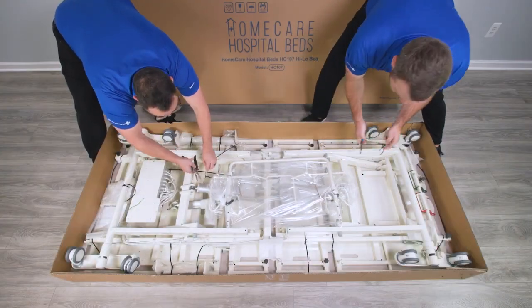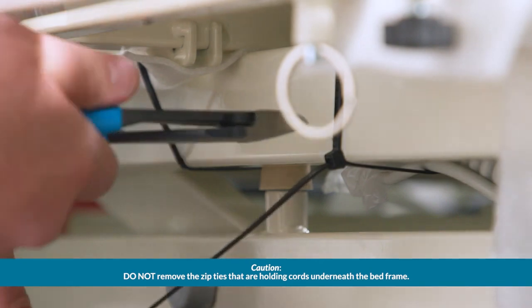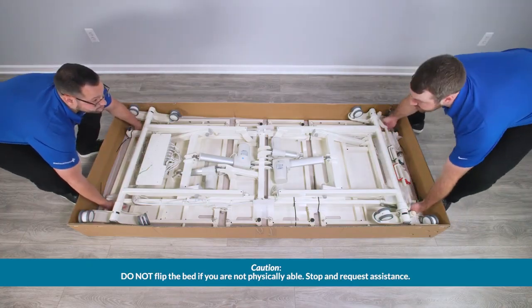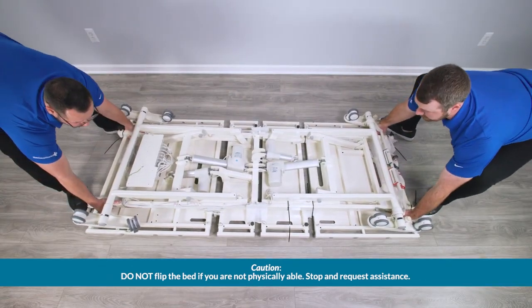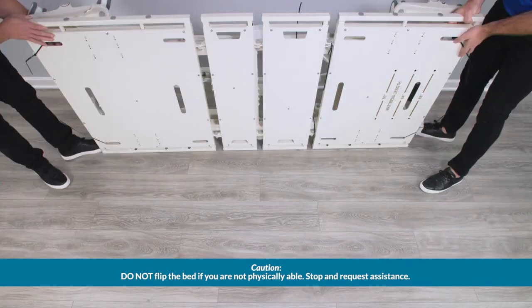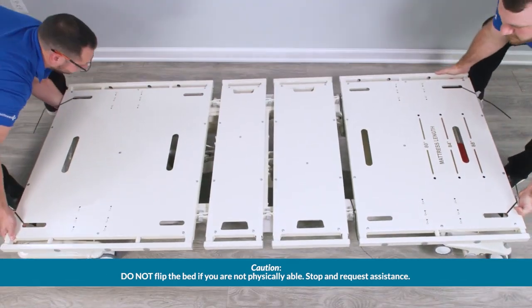Note, the bed will be upside down with the casters facing up to protect the frame and electrical components. Remove the zip tie from the hand pendant. With two to three people, grab the foot end and head end of the bed frame. In two steps, lift the bed out of the box and onto the side of the bed frame. Readjust your grip for better range of motion. Complete the flip and set the bed onto its casters.